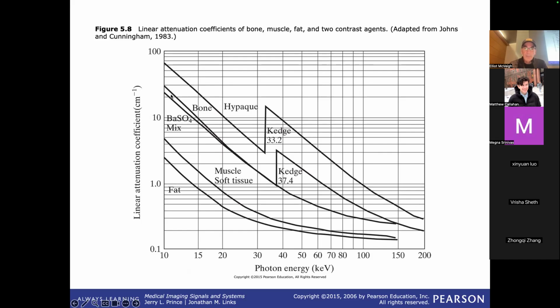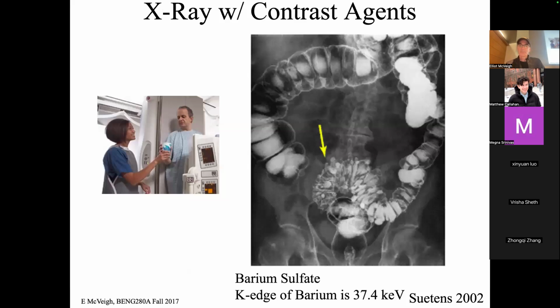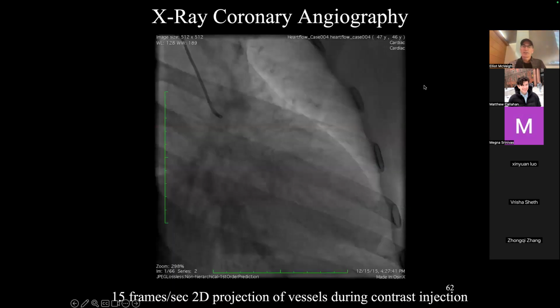This barium sulfate mixture is here. That is like bone, right? And remember that picture of that guy looking at the milkshake, like, he has to drink that milkshake. That's what's in the milkshake, this barium sulfate. Well, there he is again. He's like, oh, I don't know. But this is what it looks like when it's inside and you want to track through bowel and stuff like that, to try and see. So if you see some really weird indentations, you know what's going on there.